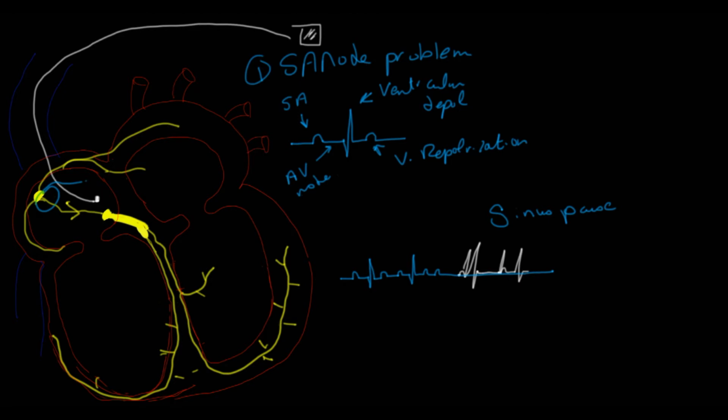Now let's clear the board and have a look at the different types of pacemakers available. Right, so different types of pacemakers.